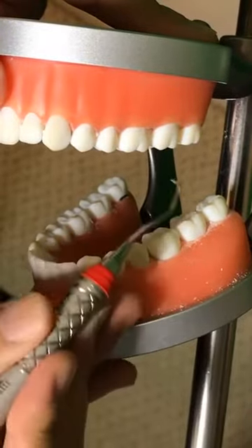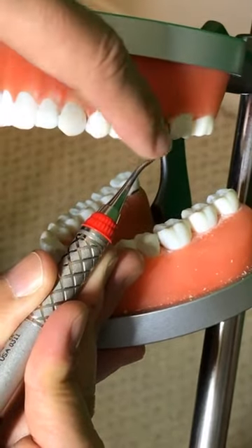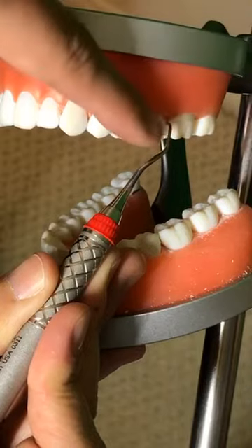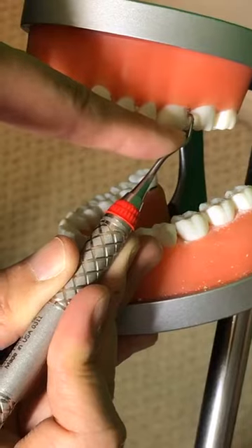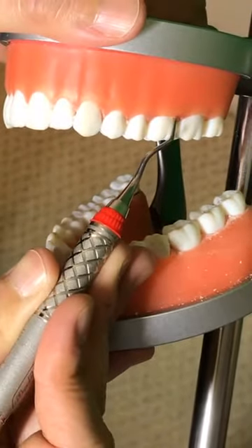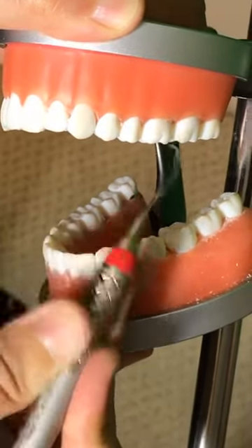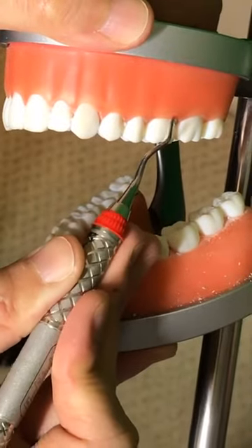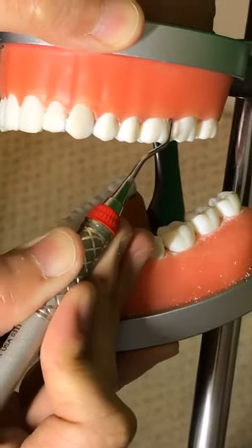Especially with the 13/14, it's easier to determine. There's another visual cue, which is this V, the bend, is always towards the distal. From this terminal shank to the first bend, this corner has to be pointed towards the distal surface. That would be the correct end to use. So that's another way to identify. My 13/14 is very sharp today because I was sharpening it yesterday, so now it sticks to the tooth.